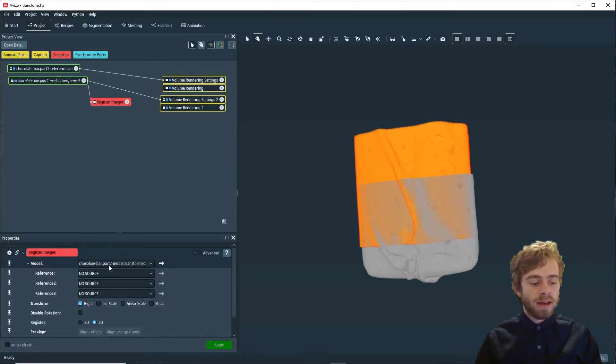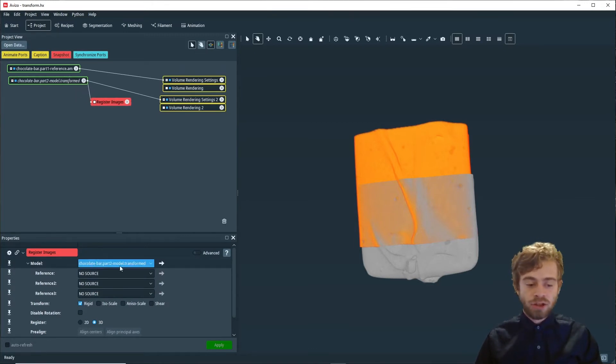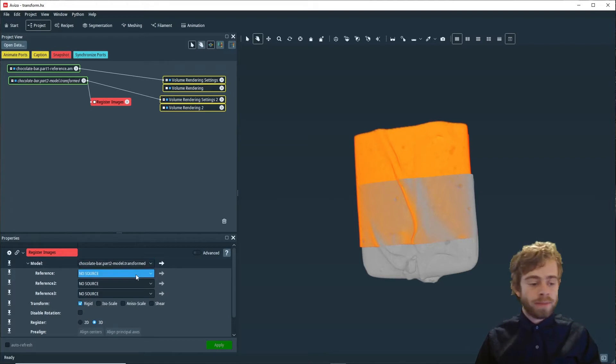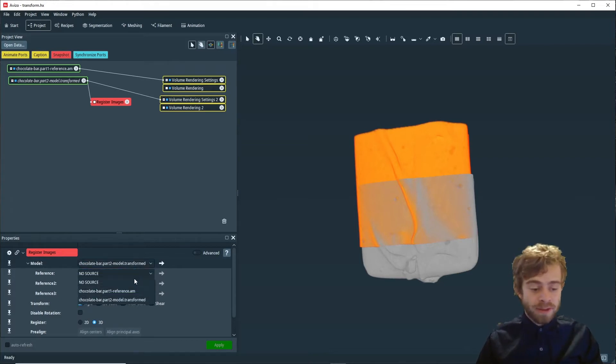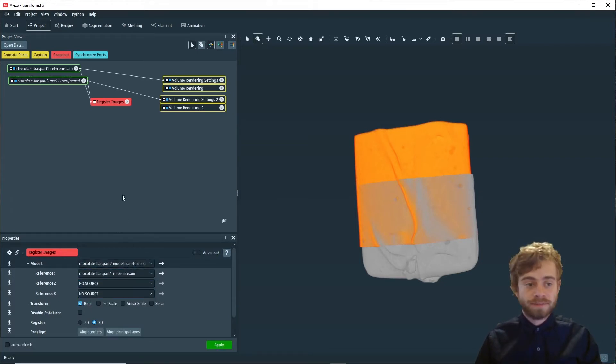Next, we're going to make sure our model is set to chocolate bar part two dot transformed and our reference is set to chocolate bar part one dash reference.